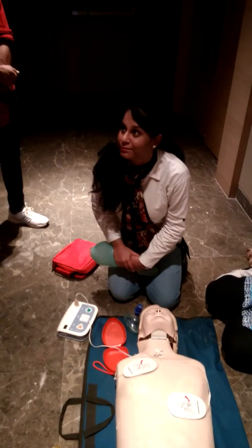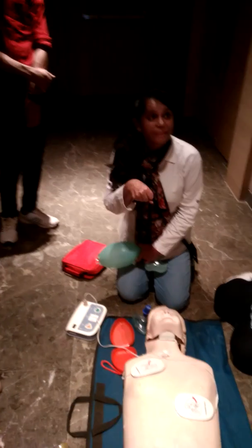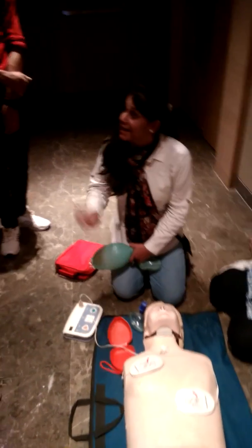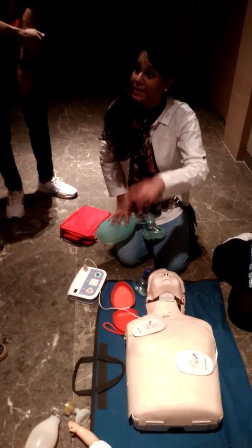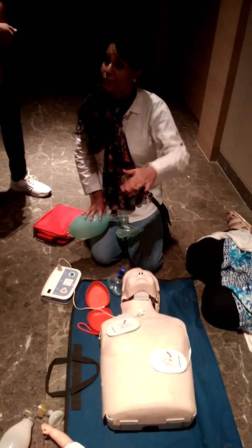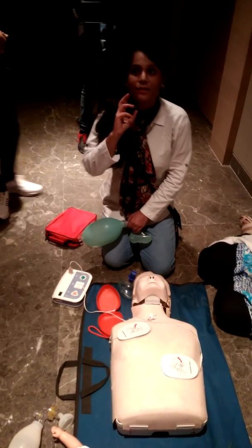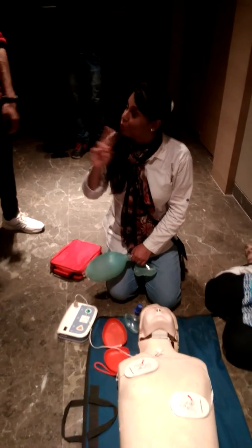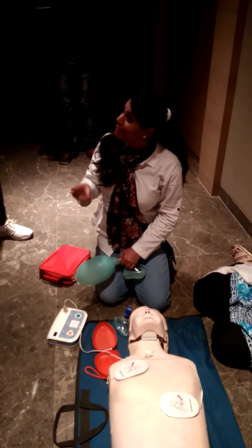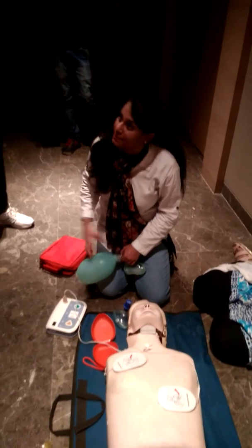When to check the pulse — whether the pulse has come back or not. When you have given the shock, you are not supposed to check the pulse immediately. Why? Because shock does not start the heart, it actually stops the heart. So when it stops the heart there is no use of checking the pulse. After giving shock, immediately resume high quality CPR for 2 minutes, and then check the pulse.